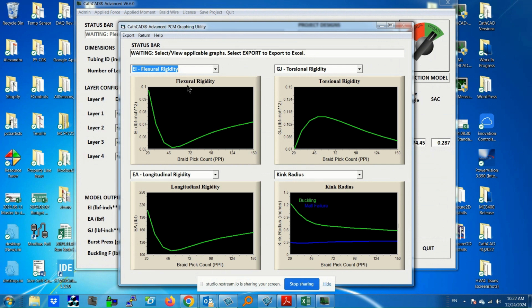Number one is flexural rigidity. So you hear a lot of times the concept that as pick count goes up, the device becomes more flexible. And the fact of the matter is that happens up to a certain point. So you can see for low pick counts, our flexural rigidity is a larger number. But then there's this minimum value pick count. And again, it depends upon the design, the braid wires, the braid angles, things like that, where you reach a minimum. And then after that, you'll see that the flexural rigidity will increase a little bit.